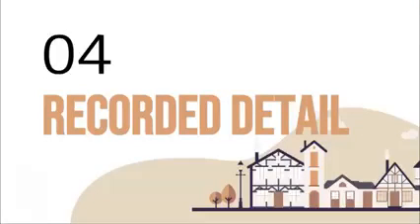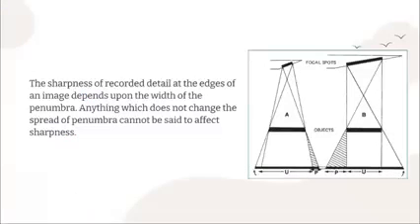Yeah, let's go to recorded detail. The sharpness of recorded detail at the edges of the image depends upon the width of the penumbra. Okay? Diba, na-discuss na ako ni previously that this area here sa kilid is what we call penumbra. Okay? Anything which does not change the spread of penumbra cannot be said to affect sharpness. Mao gini siya ang main na maka-affect sa inyong sharpness of the image.